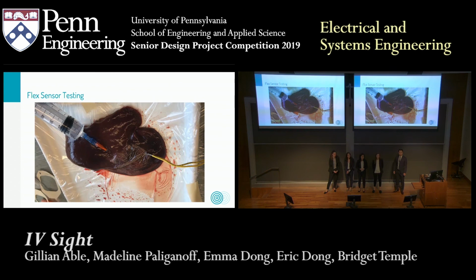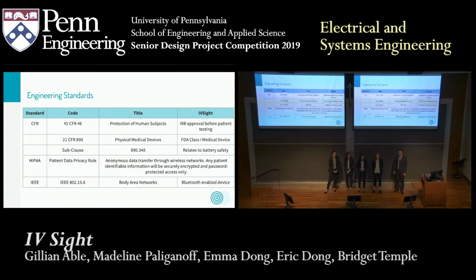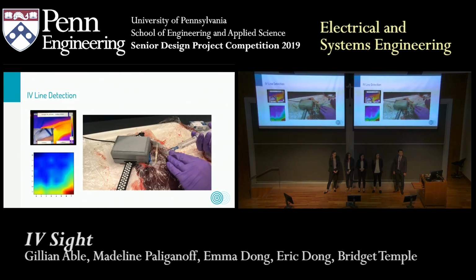The damage to the patient is tied to the amount of time it takes to identify that there's a problem. So the thermal sensor is 5 minutes? Yeah. So do you have a plan to get that down to 2 minutes, which is similar to what you've got for the swelling sensor? Yeah, the reason we chose different timing for the flex and the thermal is that thermal is detected first. So we wanted a sustained change to make sure it wasn't the patient moving the device or fluid or water spilling onto it. It's because the thermal reaction of the actual body is slower than the actual swelling, which is based on the flow rate of the pump.